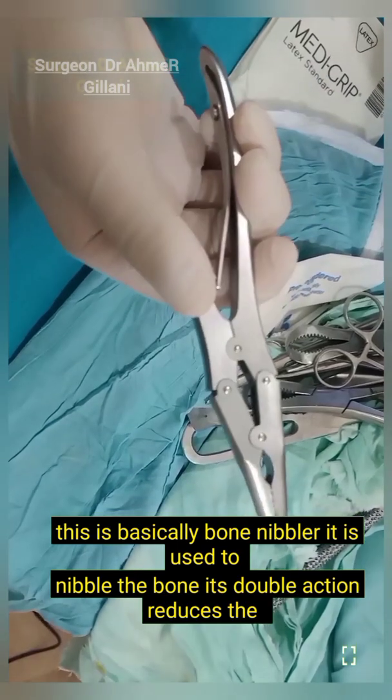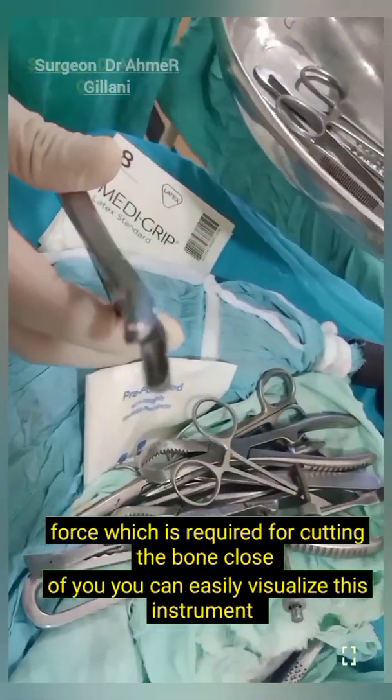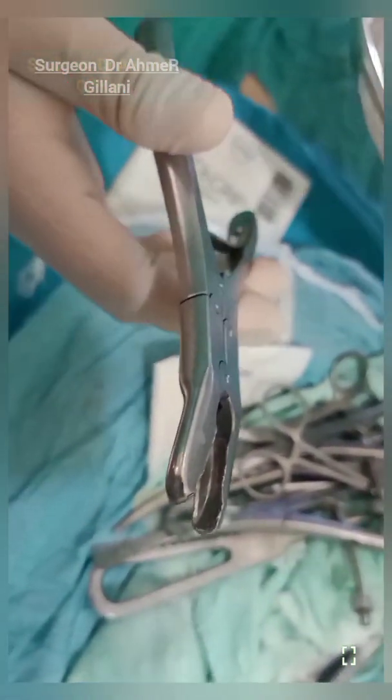This is basically the bone nibbler. It is used to nibble the bone. Its double action reduces the force required for cutting the bone. In close view you can easily visualize this instrument.